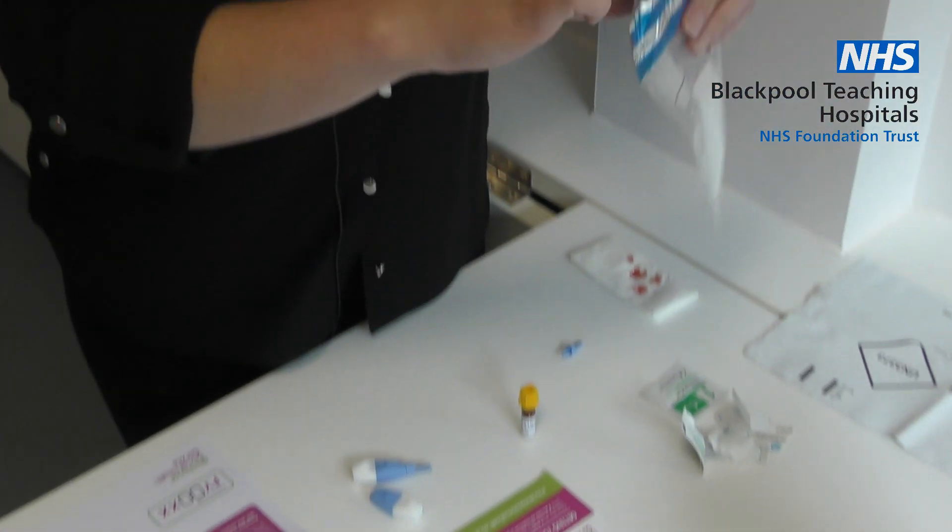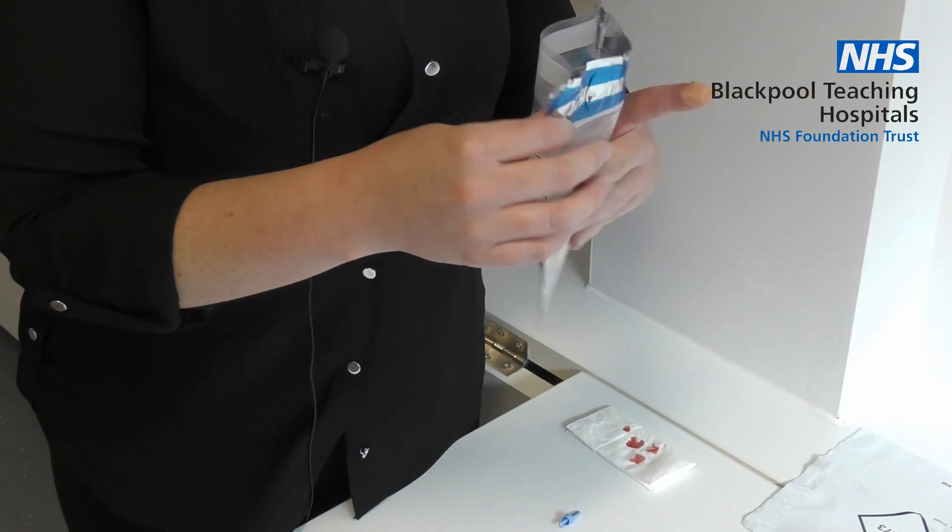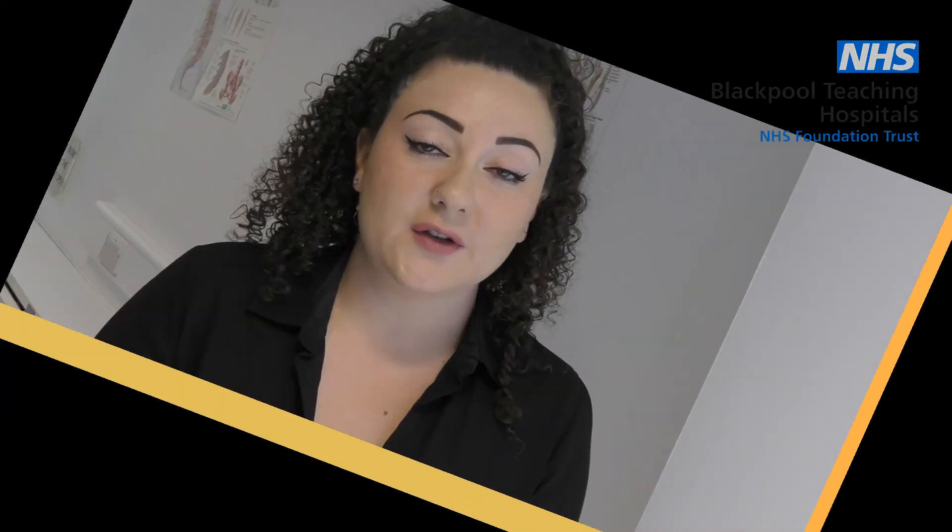Place your samples into the clear bag provided and seal the bag. If you don't manage to get enough blood, then please send your sample back as the lab may be able to test for one infection rather than two.